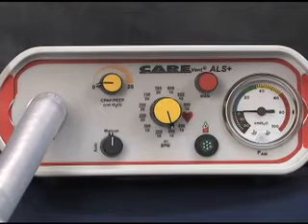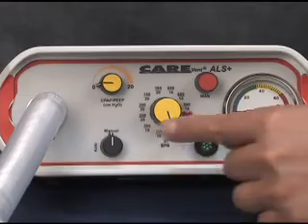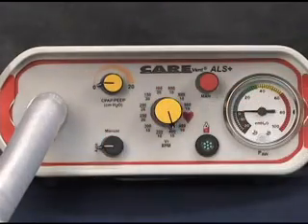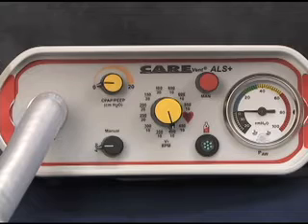With the manual auto control in the auto position, the CareVent ALS Plus or ALS Plus CPAP will provide automatic ventilations at the rate and volume selected on the rotary setting selector control.